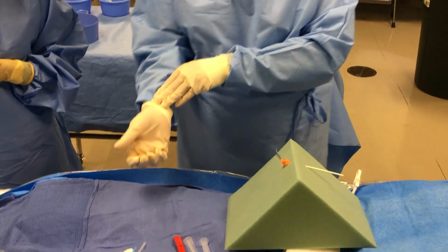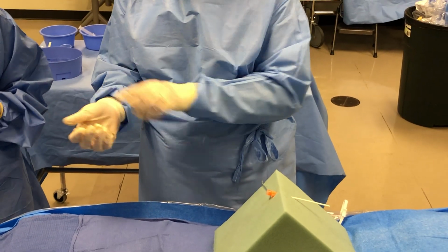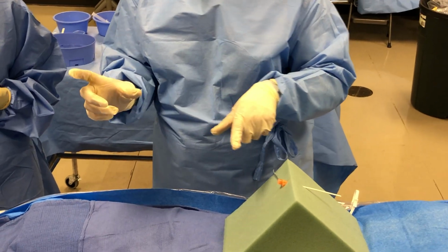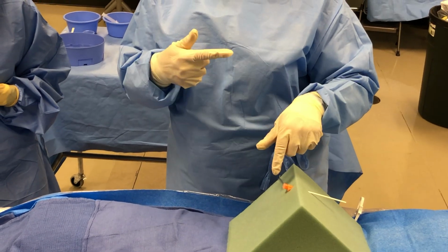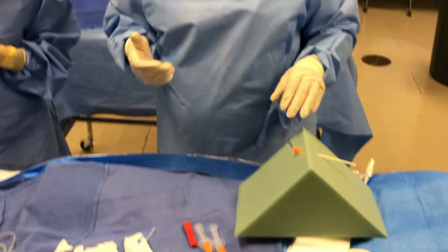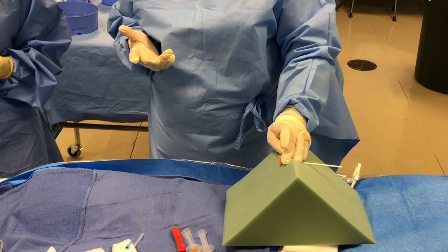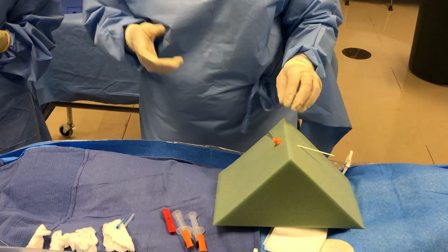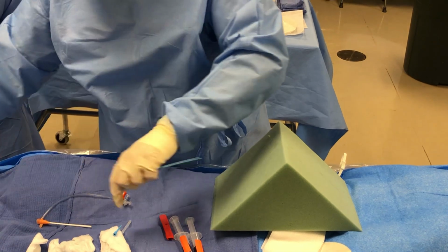It's gonna be very similar to the radial with maybe just a little tweak. If we use a micro puncture, we might actually have a smaller little tube that we put in first, put the wire in, remove that tube, and then put the sheath. So it just depends on whatever tools they're using for access. Okay, now, before I demonstrate flushing, we'll go back and demonstrate.